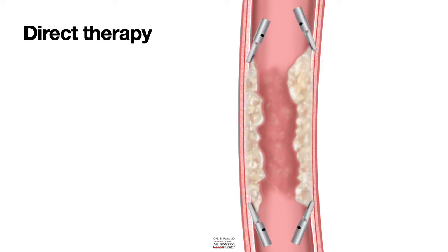Clips are also useful in directing radiotherapy. By marking the site of cancer, the clip could be seen by the radiotherapist, and they could direct the radiation to the cancer. Although there are so many applications that people have come up with, the two most commonly used applications include bleeding control and defect closure.